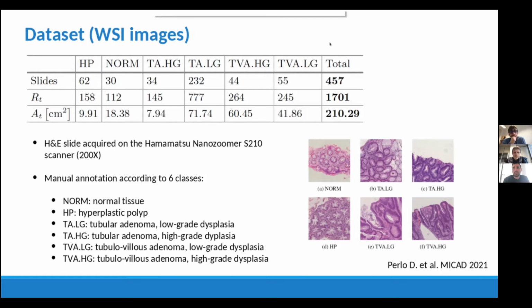So our efforts have obviously started by collecting data sets. And this was an enormous effort by the pathologists. In total, we have collected around 450 whole slide images, and as you can see in the table reported. But it was not enough, because as you can imagine, in a single image, there may be different types of tissues. So for example, we could always have probably some normal tissue. And so it's not enough to just use the entire image, even if it was possible.